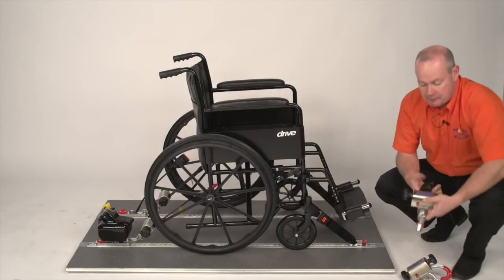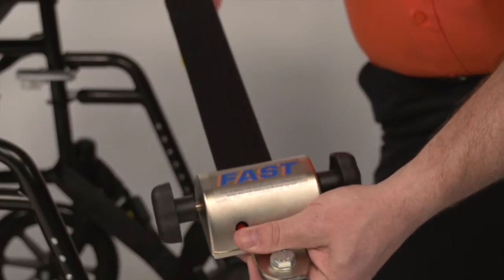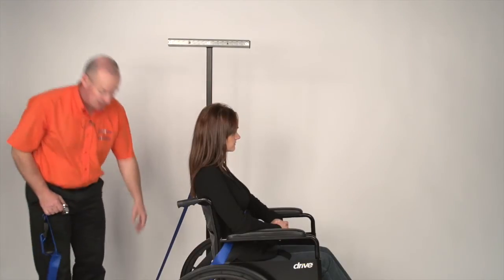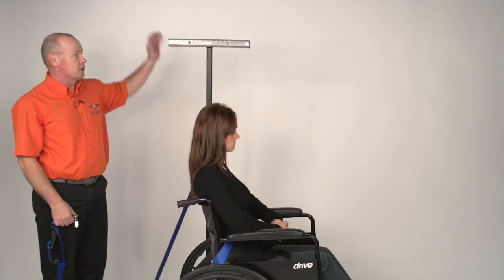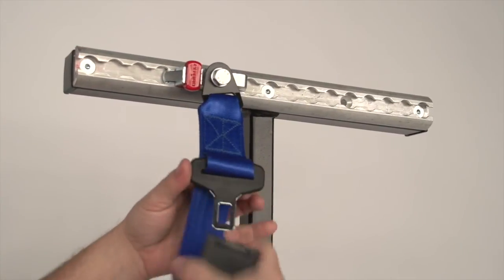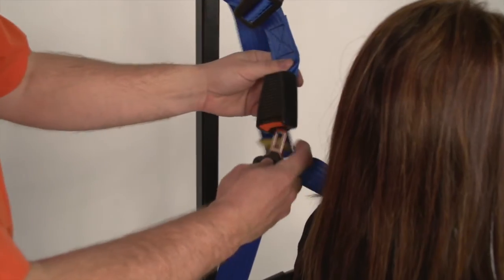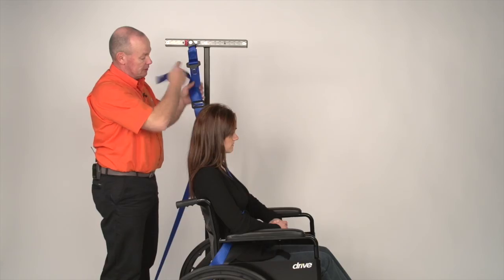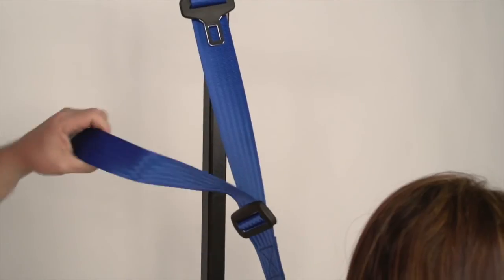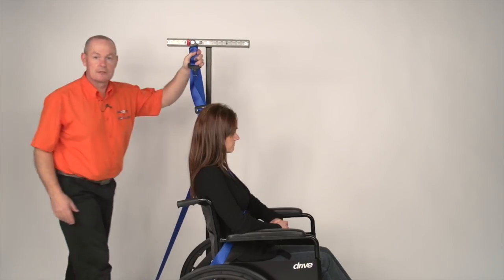Other options available at the front: you can have the FAST system instead of the static front straps with the buckle and tongue, or you can have the FAST with the carabiner. All of our passenger harnesses come with a floating tongue. This is used in conjunction with the CAT rail system and a third-point fixing. You place that into the track, undo the tongue from the buckle, bring the floating tongue up and attach it to the buckle. The buckle is adjustable so that the tongue should be roughly two inches off the shoulder and just behind the ear of the person — this gives you the same type of fixing you have in your car.